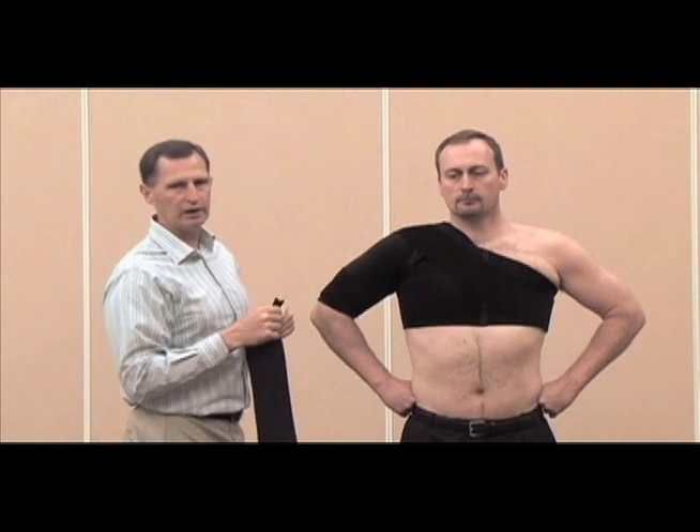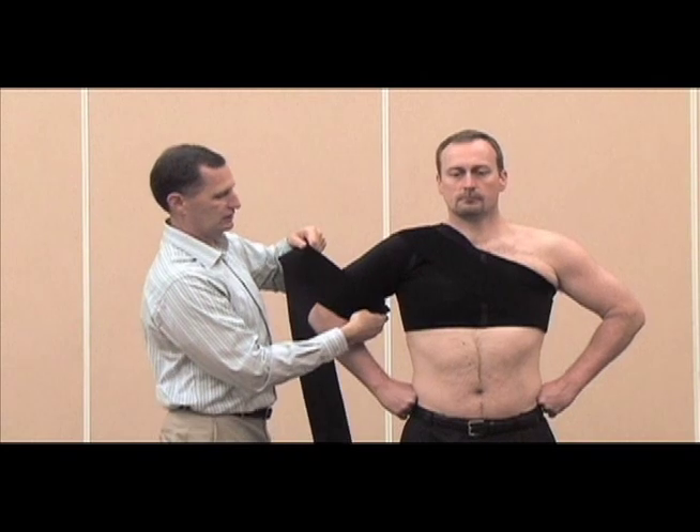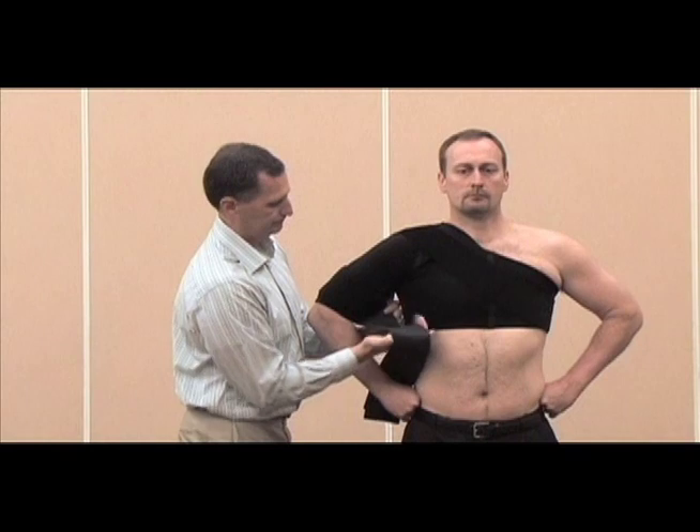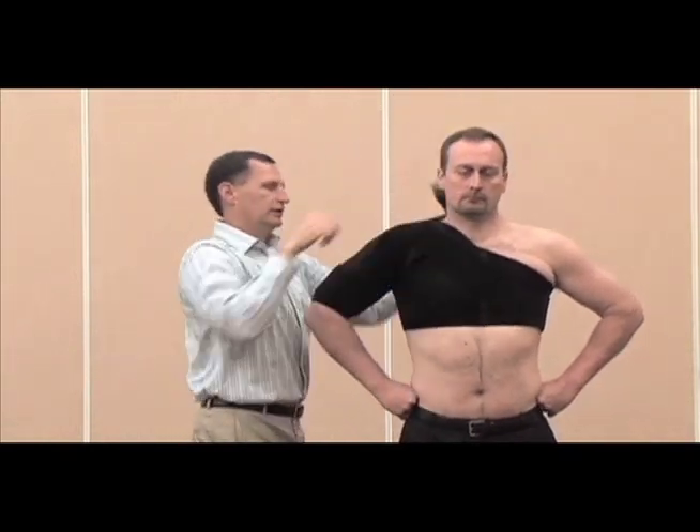For the other supporting strap, go in the exact opposite direction — same thing, just face the bicep, through the armpit or over the top of the shoulder, and secure it.